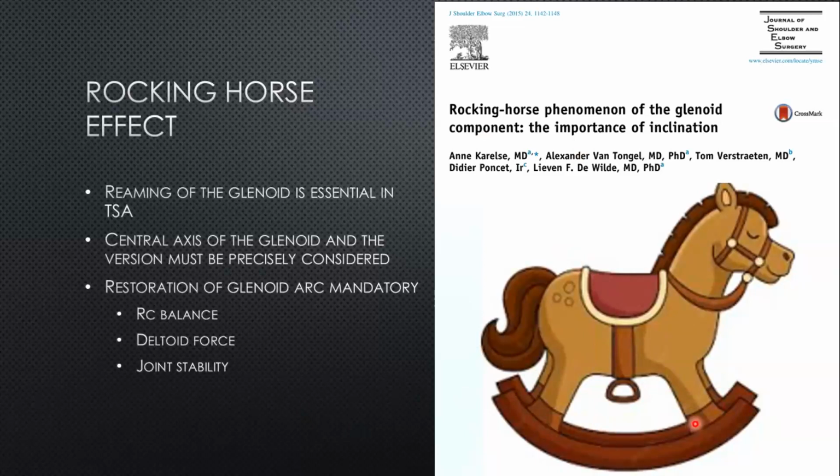So what happens in this case is that in the anterior and the posterior rim, there is excessive loading. During rotation, it starts transferring from the anterior rim, goes all the way through the face of the glenoid and comes to the posterior rim and creates an increase in the force that acts on the rims basically. And that creates a possibility for acceleration of glenoid loosening.